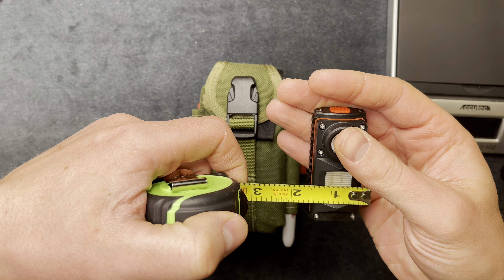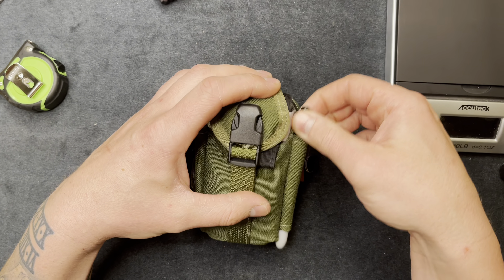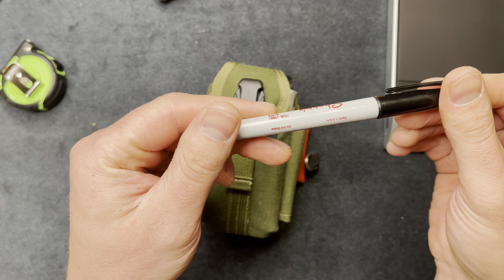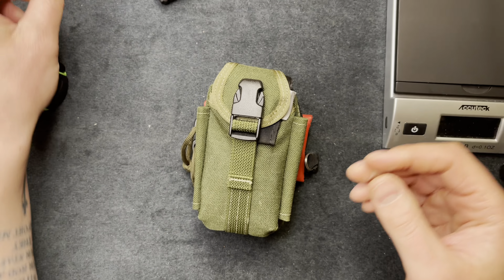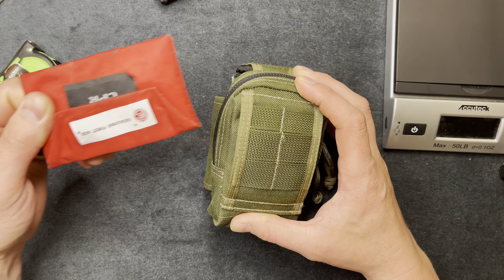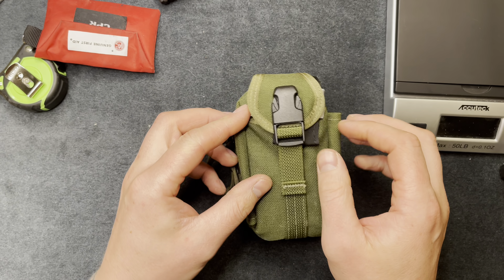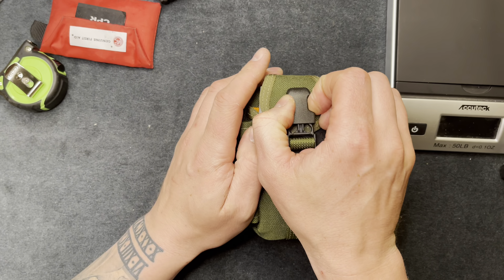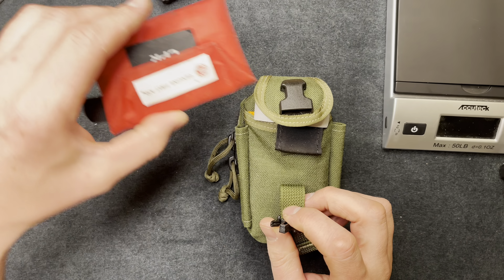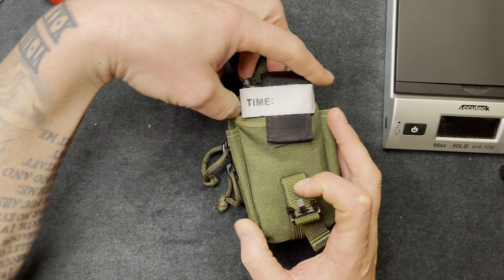Next up I have a Sharpie. On the back here I have a CPR mask — it actually came from my last job, so I still have it and I'll keep it in here.